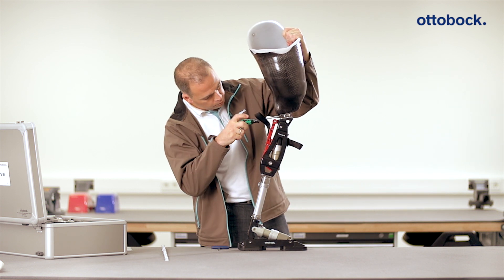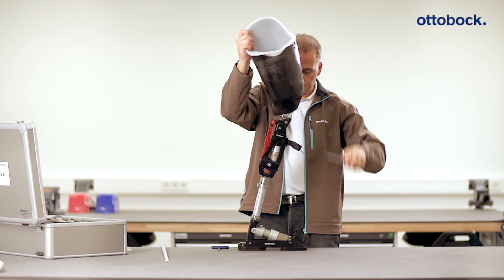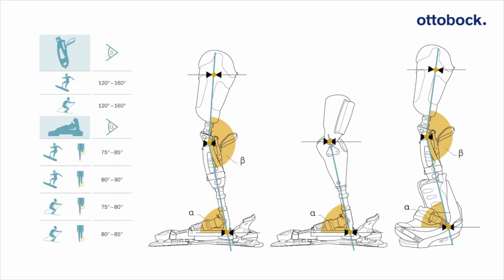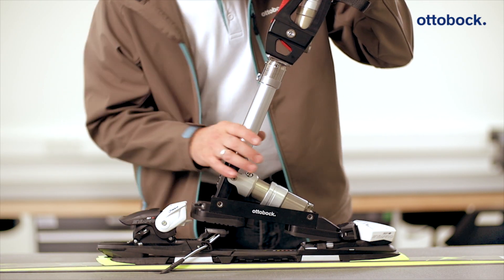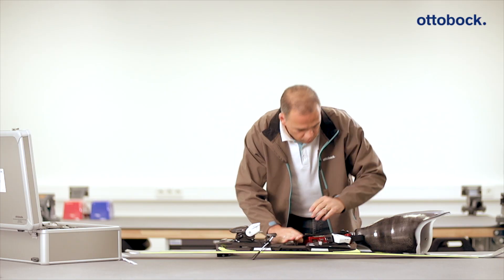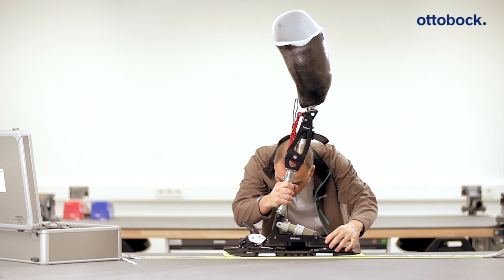Position the socket so that the ischial tuberosity reference point is located at the height of the ischial tuberosity to floor measurement. Check the flexion position against the table using a goniometer. The ski binding should be adjusted by qualified ski personnel. It is necessary to ensure that the Pro-Carve foot is positioned in the middle of the ski so the ski has optimal movement properties. A corresponding marking is found on the Pro-Carve foot.